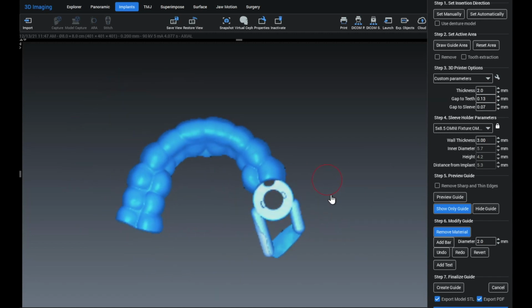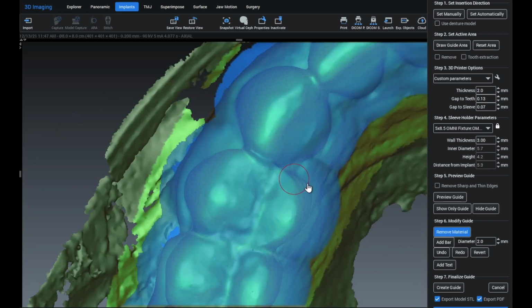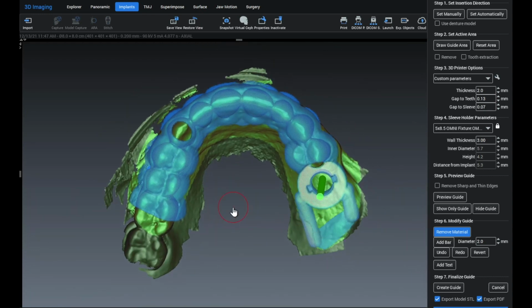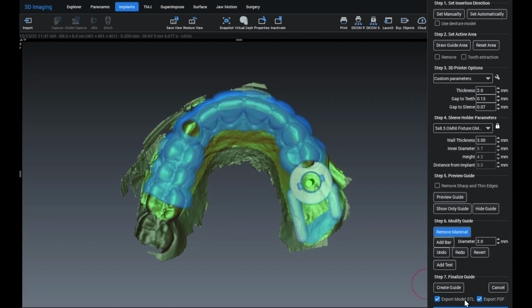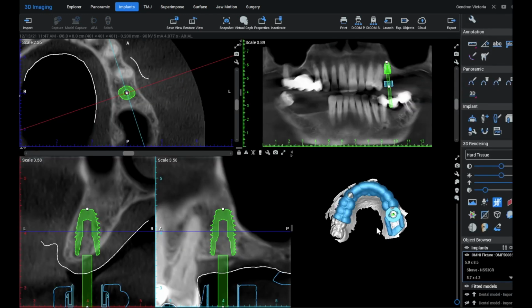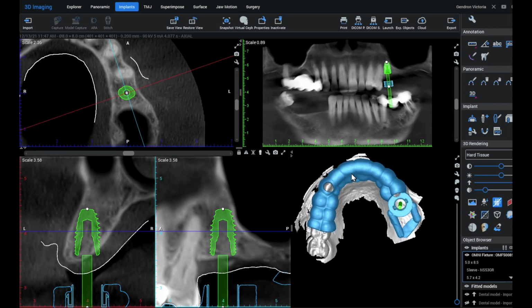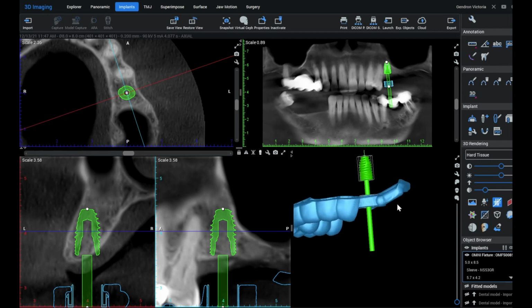When you start doing these cases, if you plan and include this little posterior stop, you're going to notice a difference when you're drilling. The guide is just going to feel a lot more stable when you're bottoming out your drill on these posterior implants. It's just going to feel firm and stable. And I especially like it for those cases in the posterior mandible, like I said, where you're doing premolars and molars, especially if you're doing multiple implants. Those are the cases I think that pose the most risk.